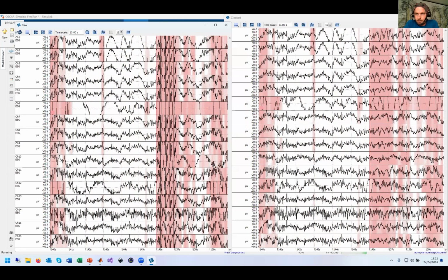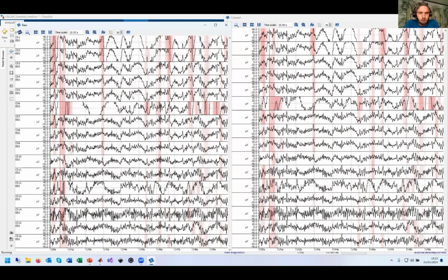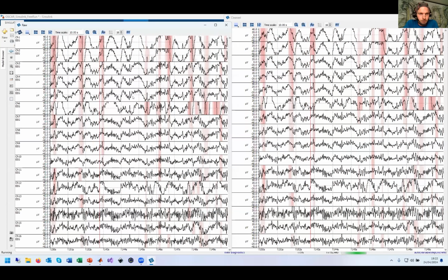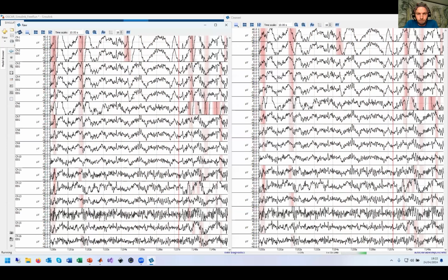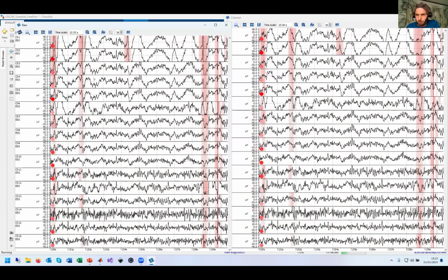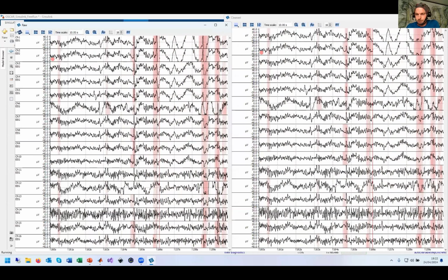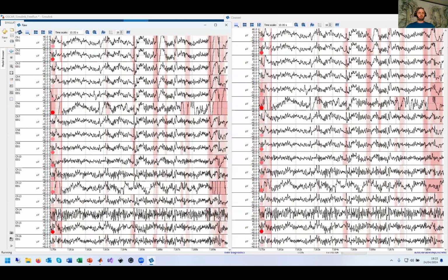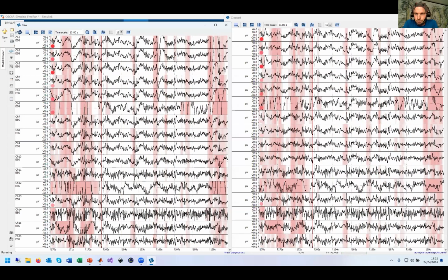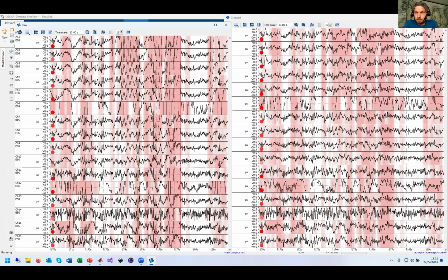We still have, to be honest, some issues, but we have a fix for that already. Not demonstrated today, but we are having some issues with alpha. So let me do some alpha. Sometimes it's corrected, but we're, yeah, well, not now. Yeah, so that's nice. Visually, it looks good, I would say. What else do we have? Maybe some crazy eye stuff.